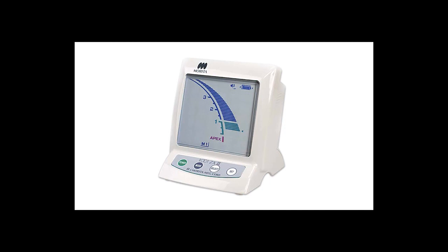Therefore, two separate frequencies, high and low, will create a ratio much less than 1. However, if the distance between the two plates, or the file and the tissues, is great, then there is little impact of frequency on impedance, and therefore a ratio of a high frequency over a low frequency is close to 1.